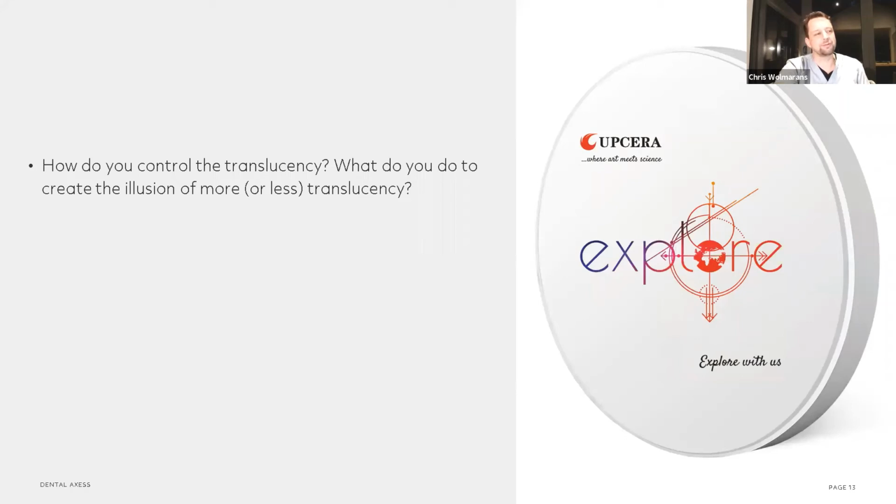I feel we've got good results just from staining accurately. And I think good aesthetics does come from good staining pre-sintering and then following up with some accurate, nice effects afterwards in your glazing process. That combination together can give you nice results.